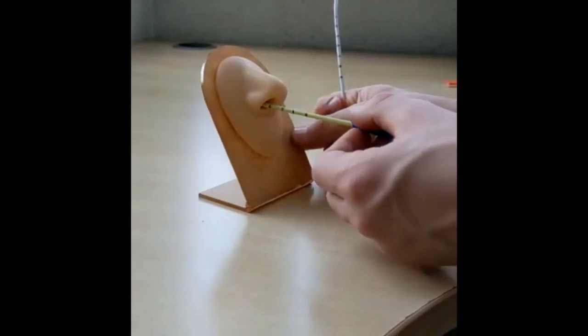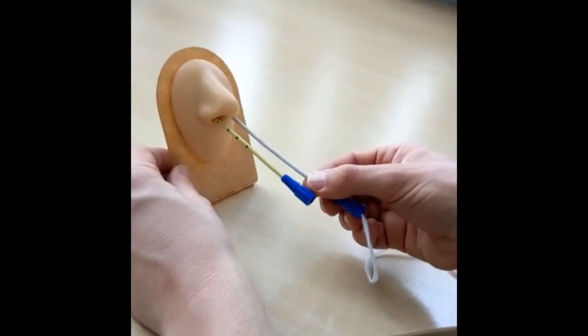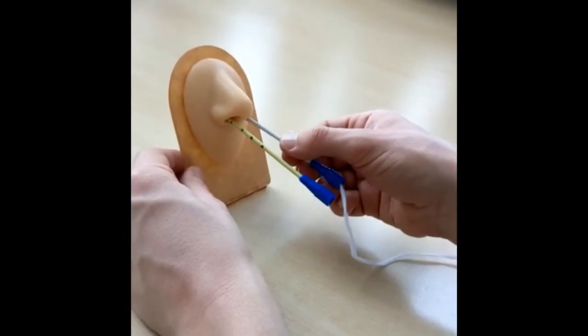Before starting, check for anatomical abnormalities such as nasal septal defects and ensure there is no history of fractures to facial bones or the base of the skull.